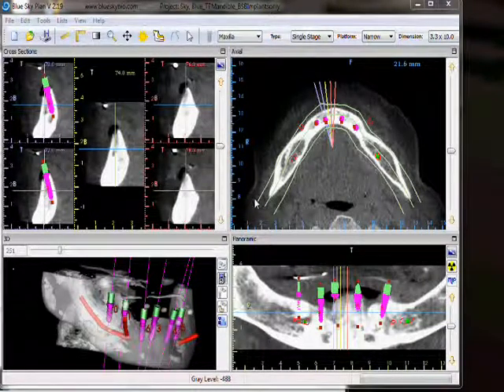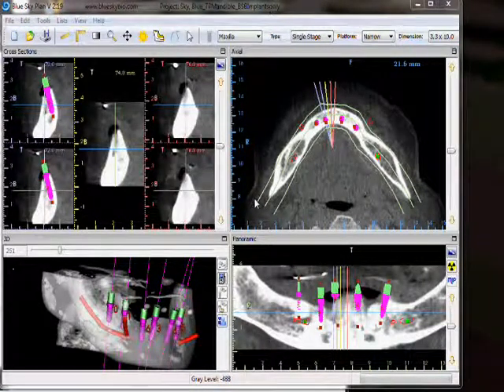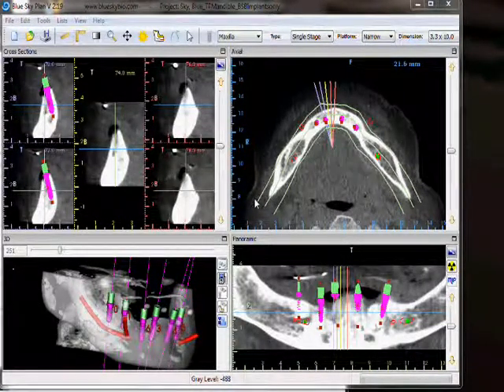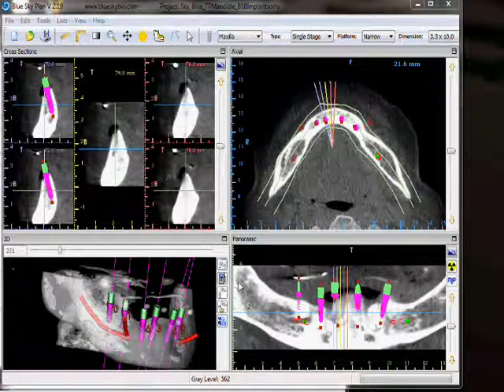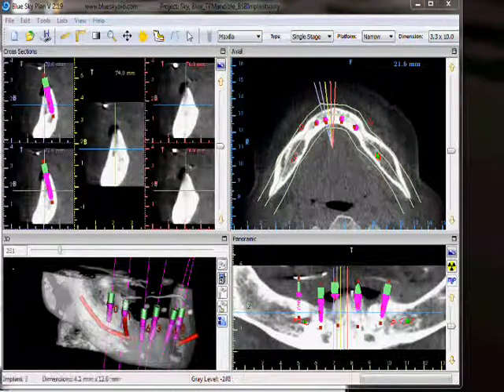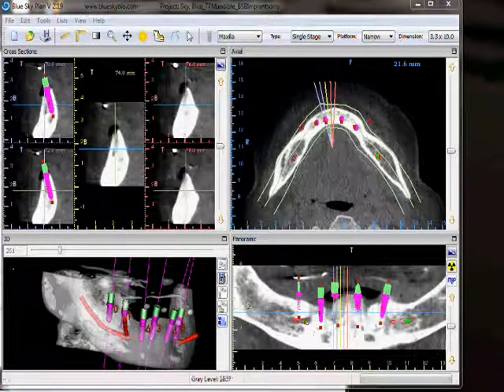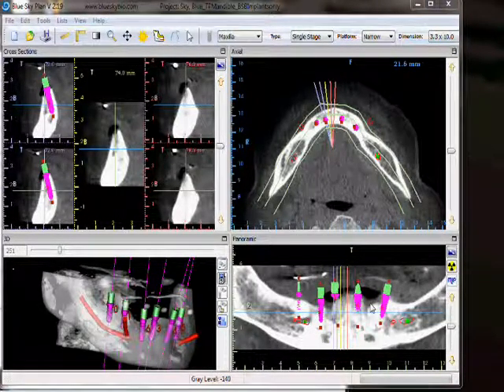Welcome to the Blue Sky Plan screen overview tutorial. We are going to start by taking a look at the panoramic view in the bottom right.